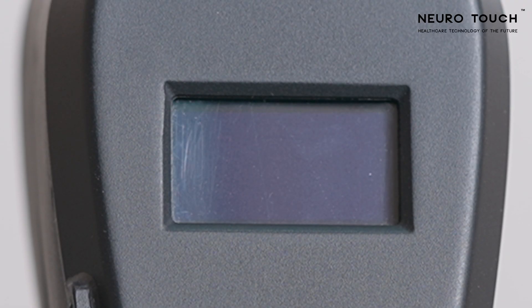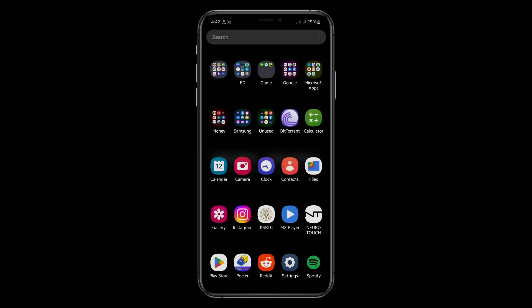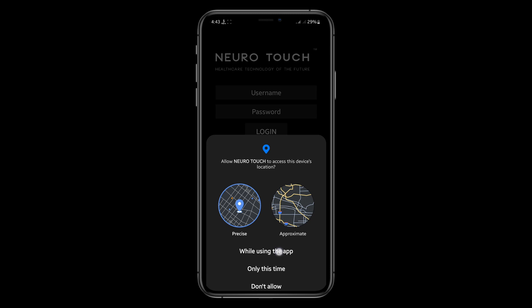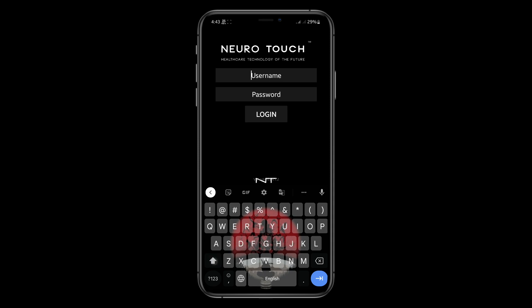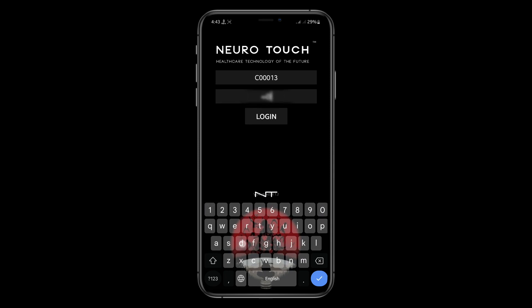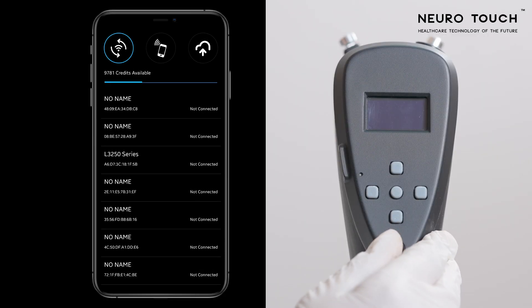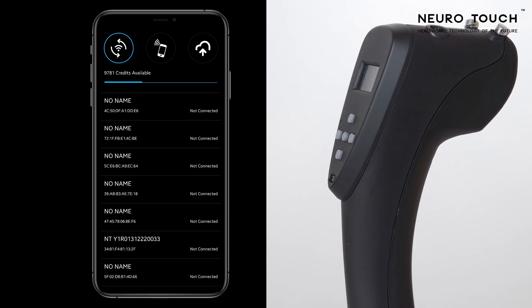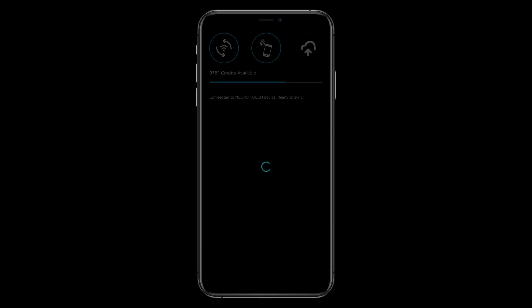Toggle the power key to the left to switch off the device. Data Transfer: Download the NeuroTouch app from the Play Store or App Store. Open the app and allow all permissions. Enter your user ID and password, and enable Bluetooth and GPS for the app. Switch on the NeuroTouch device. On the back of the device there will be a device serial number, and the same number will appear on the app. Click on that number to allow pairing with the device.